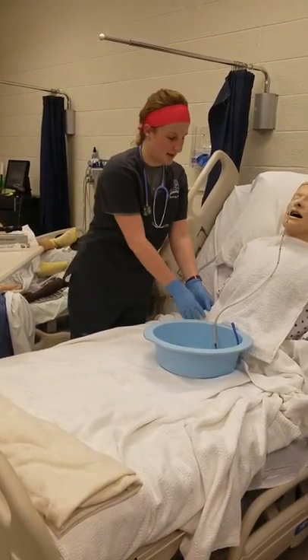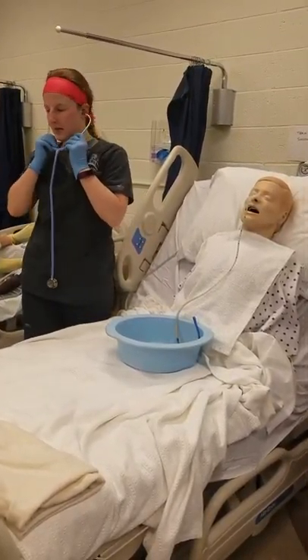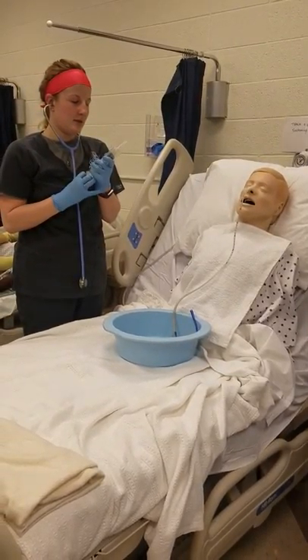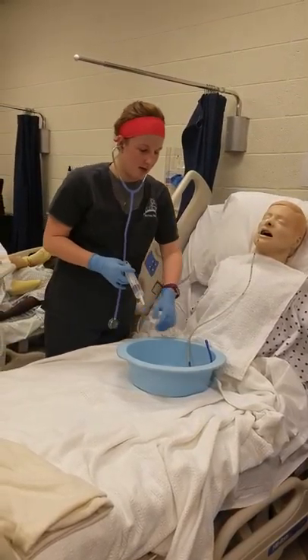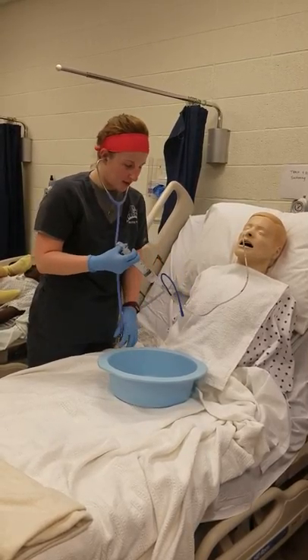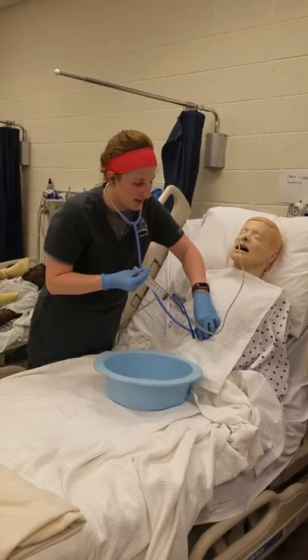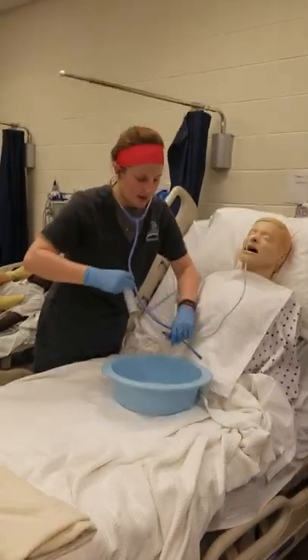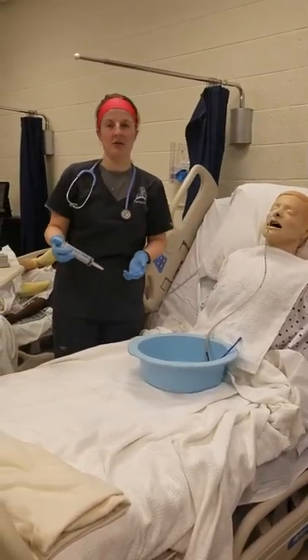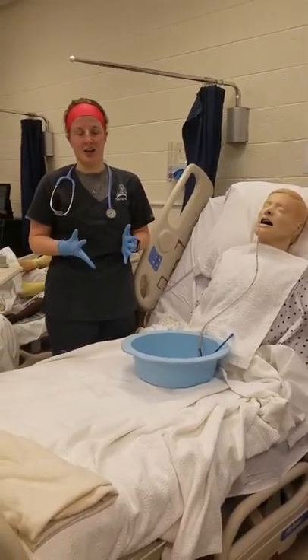Now to check placement, I'm going to pull up 20 mLs of air. I'm going to place my stethoscope over his abdomen and push it and listen for a swishing sound. I heard a swishing sound, so I'm going to say that we're in the right area. My patient's not coughing, so I don't think that it's in his lungs. To confirm, we could do an x-ray to check the placement for sure.